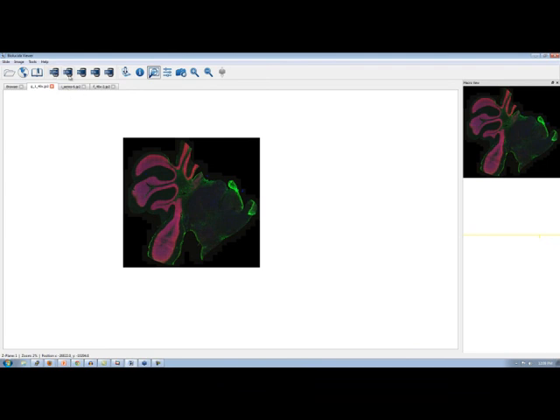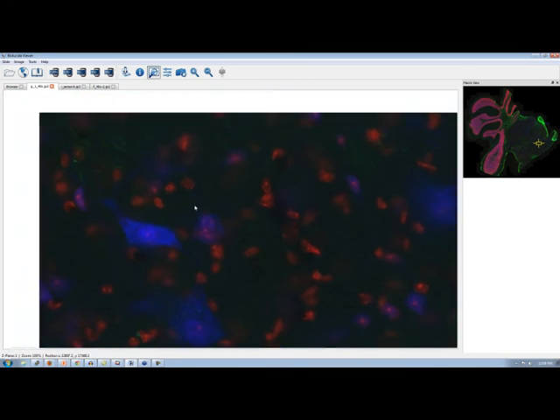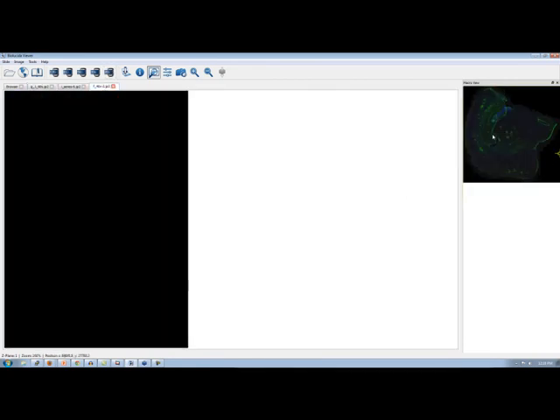One of the ways to do it, up at the top here, you see a number of lens icons. And to zoom, you can simply click on one of those lens icons. And what that does is it immediately takes you to that magnification. Now, I just want to mention, while we're talking about these lens icons, these are actually dynamically generated. And it's done so such that the one that you see on the right is the magnification that that image was captured at. Okay. So for this image, it was captured at 20x. I see. Whereas for another image, you might see it captured at, say, 40x.